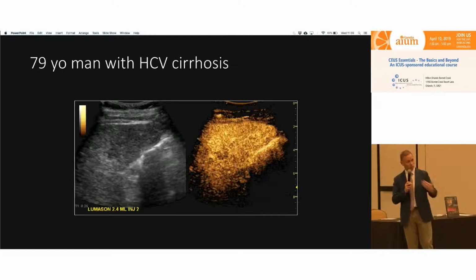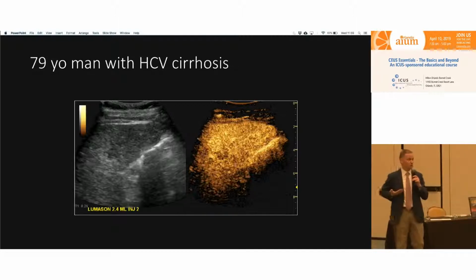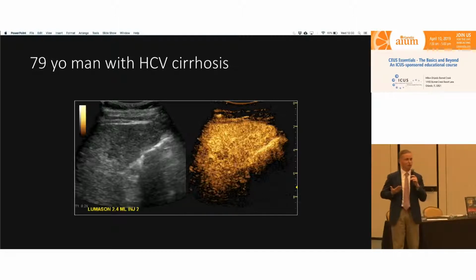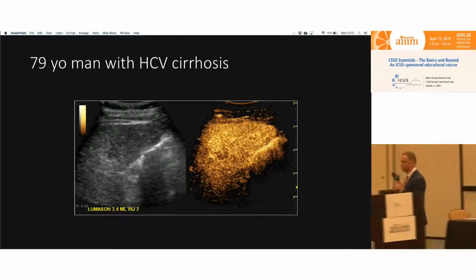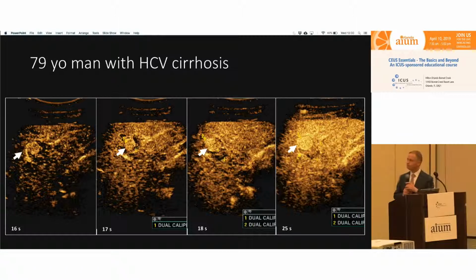So when the liver moves, this lesion will be in the field of view. If you absolutely cannot do it, if you have to have a transverse approach, if you have to stay in the intercostal space, then do breath holds. Practice, do very shallow breath holds and try to time it appropriately so you can get arterial phase hyperenhancement, and then you can go back and do washout.